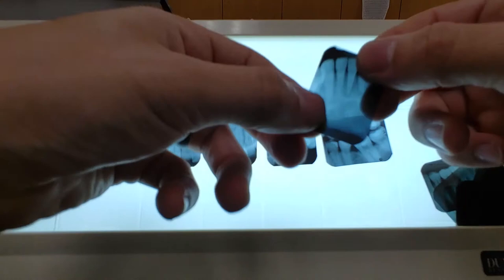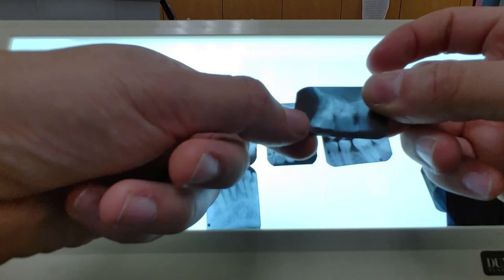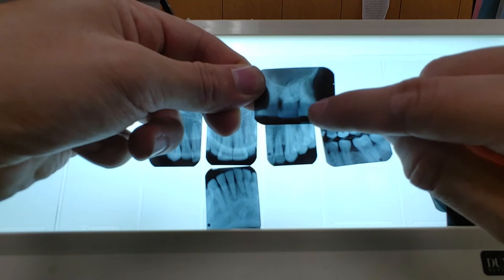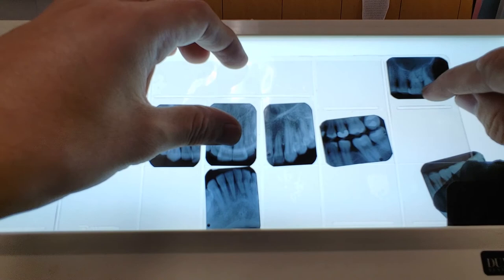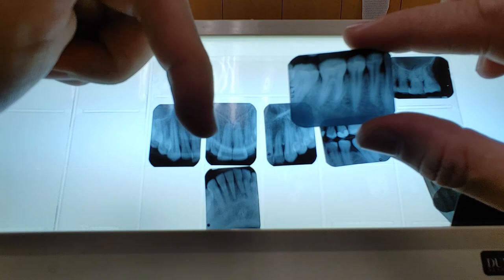Next shot: feel for the dot — pimple confirmed — I see a canine with a large wide root and wide incisal edges. Next: feel the dot — pimple — very small-width teeth in the front, so I place this as a central. Next one: it's a dimple, so I flip it to the other side — now I have a pimple. I see a maxillary sinus right above the roots and no teeth extending further back, so this is the last molar shot, going on top because of the maxillary sinus, showing those three roots — palatal, distal, mesial. That one's shirts.